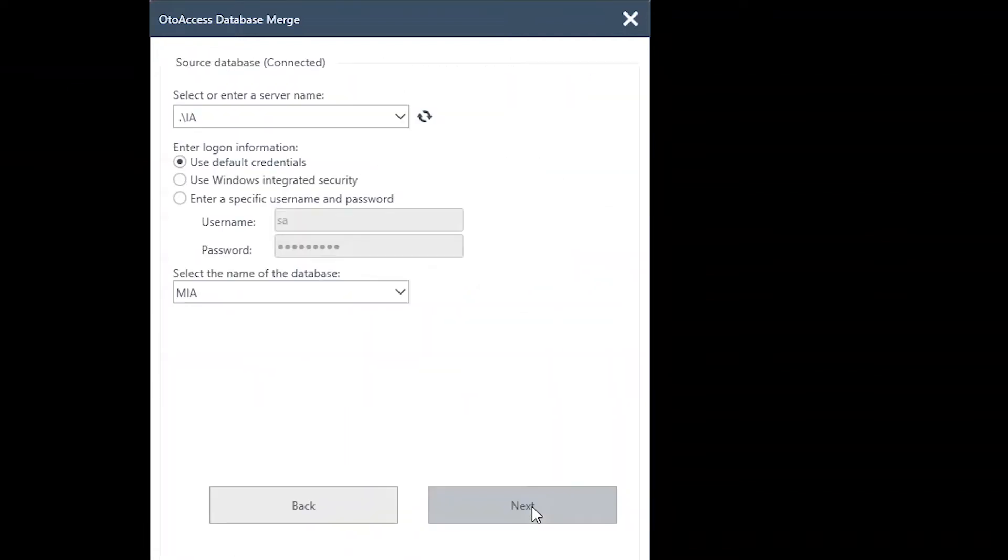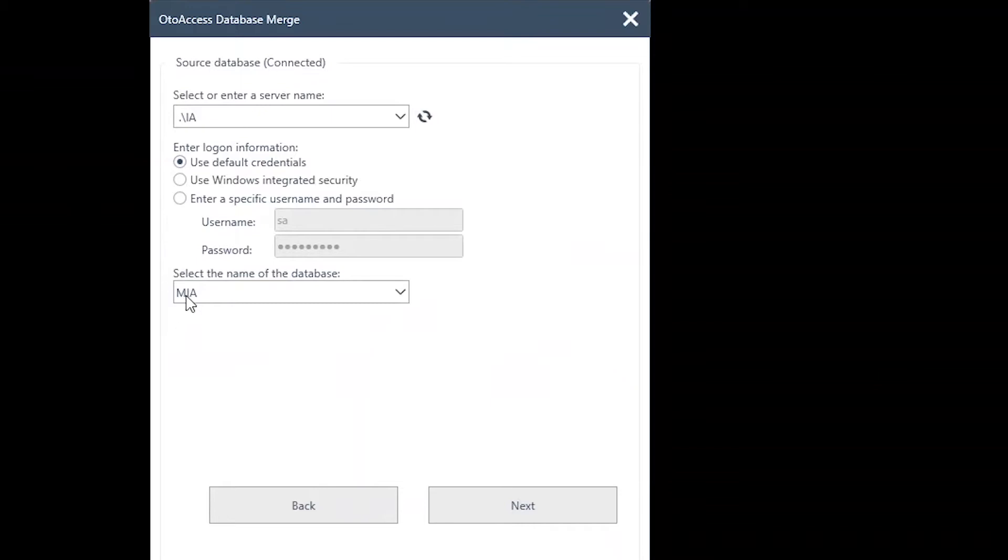We are just going for default setup in this instance. As you can see, it has already connected to the source database, the old MIA database from AutoAccess older versions.